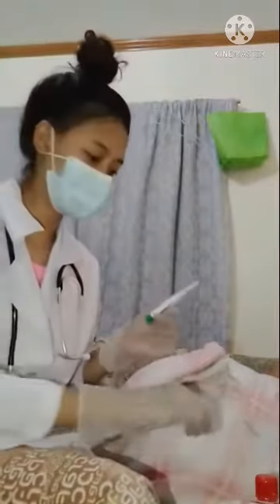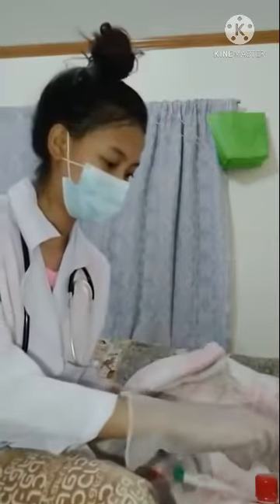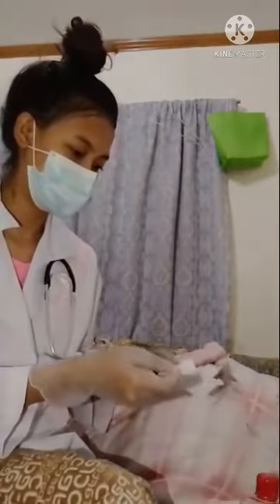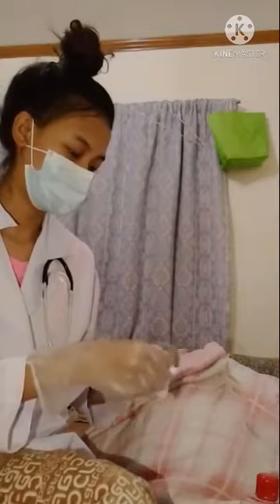And then after that, remove the rectal probe and cover it with a disposable cover. And then after that, lubricate 1 inch with a water soluble lubricant.